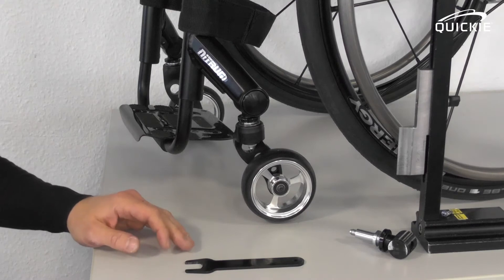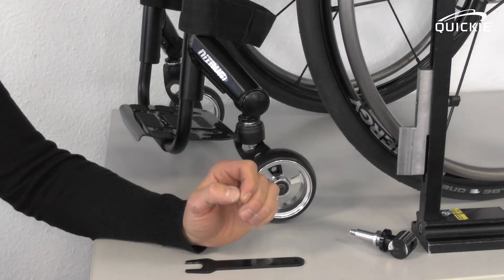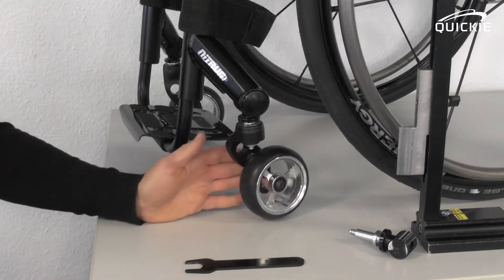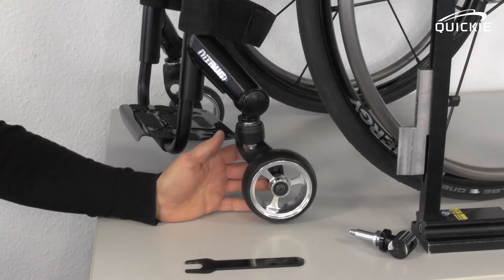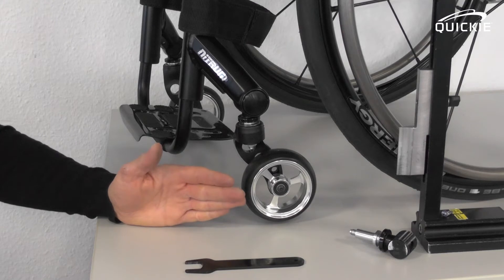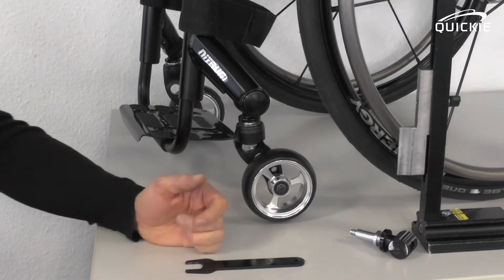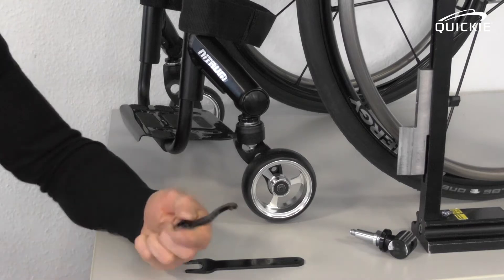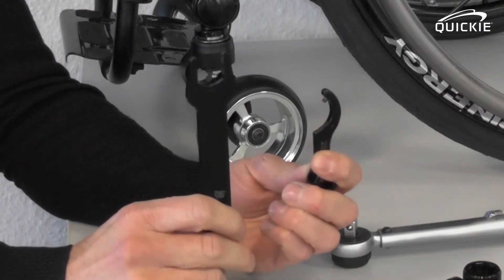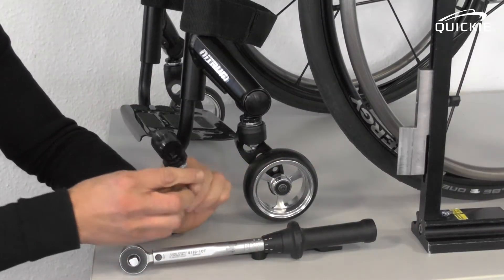Let me show you some of the more advanced adjustments on the NITRUM's caster housing. These procedures are necessary when you either have what we call a floating caster wheel — which means not all four wheels touch the ground — or the chair veers to one side and you want to adjust the straight run of the chair. You will need special tools for this adjustment. Both tools can be ordered through our online spare catalog. Let me show you how it works in theory.